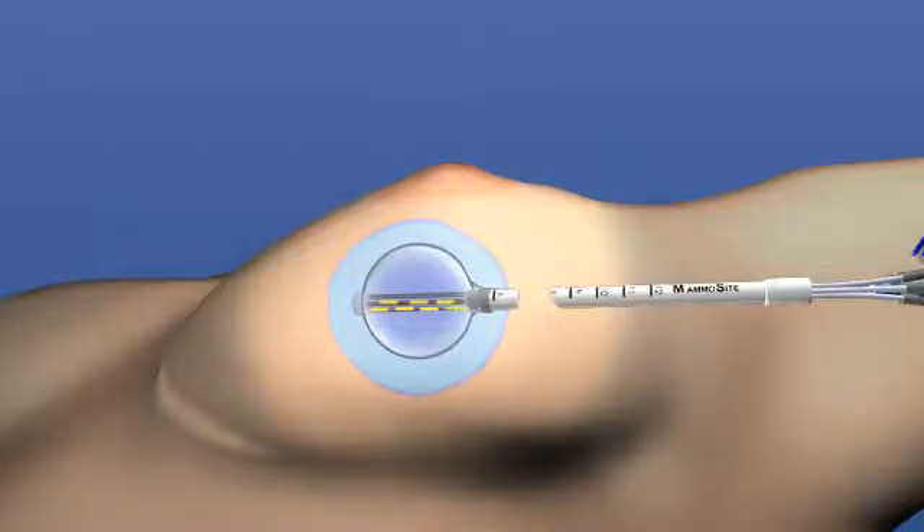The seed moves through the multi-lumens and irradiates the tumor site and the area immediately surrounding the cavity where tumors are most likely to recur.